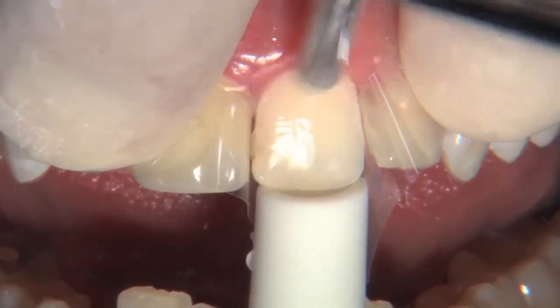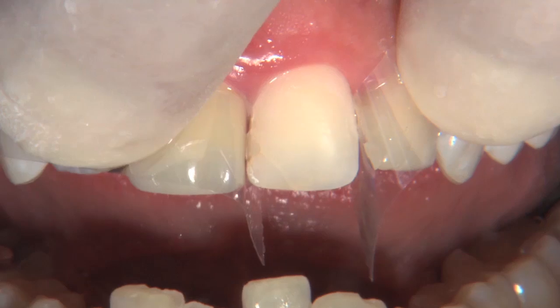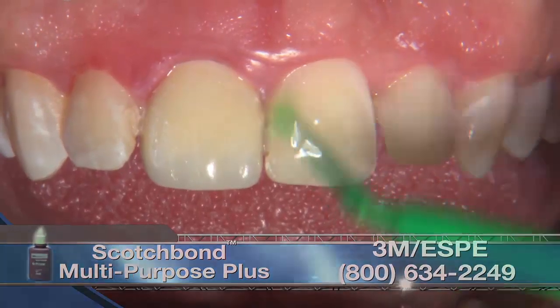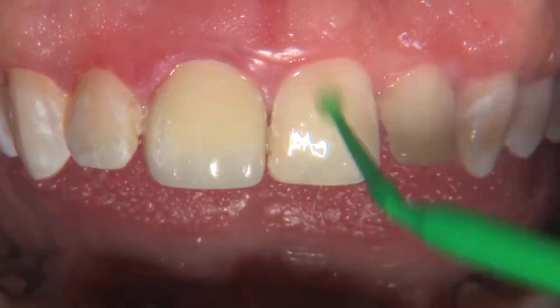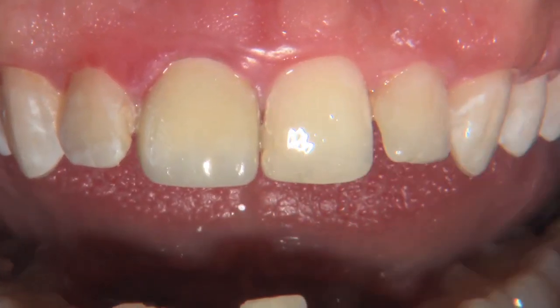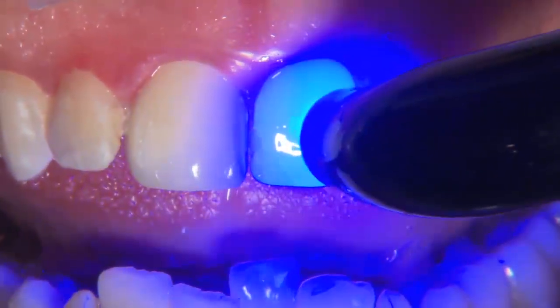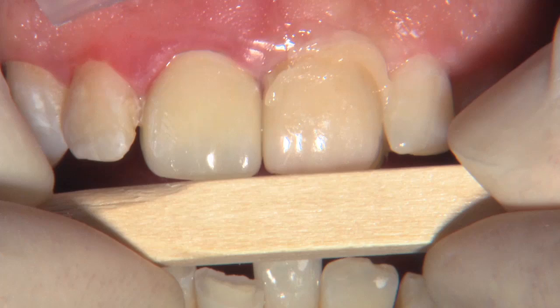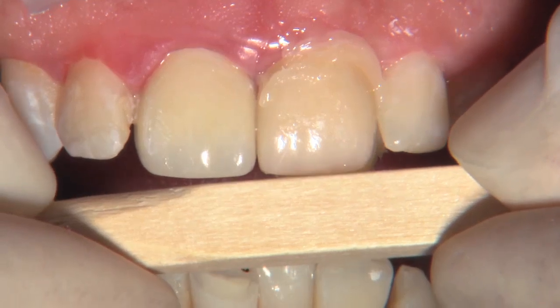We've isolated the two adjacent teeth with Mylar strips and now we're going to etch. I can get the etch right up to the gingiva — I can even touch the gingiva because this is a no-prep veneer. Anytime we prepare gingiva and do temporary veneers, the gingiva almost always ends up irritated, and acid etch near it will cause spontaneous bleeding — but we don't have to worry about that here. Since we don't have any dentin exposed, we're going right to a bonding agent without any need for a primer, from the Scotch Bond system. We're painting that on all surfaces of the tooth and it's okay to get a little on the gingiva — that will all be cleaned up later. We'll air thin that and go ahead and cure it.